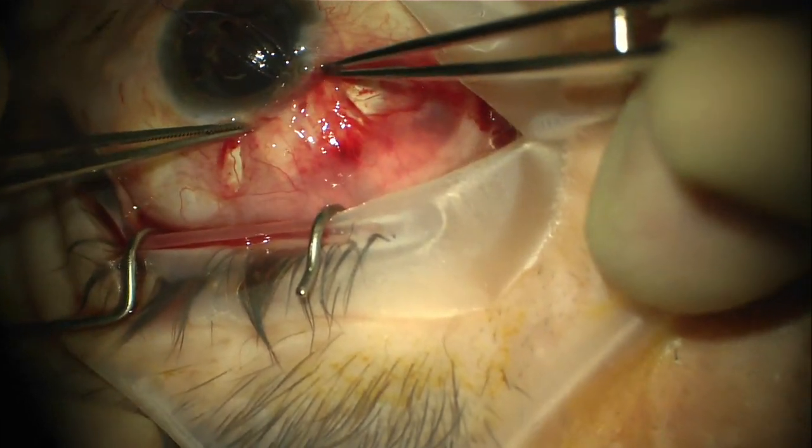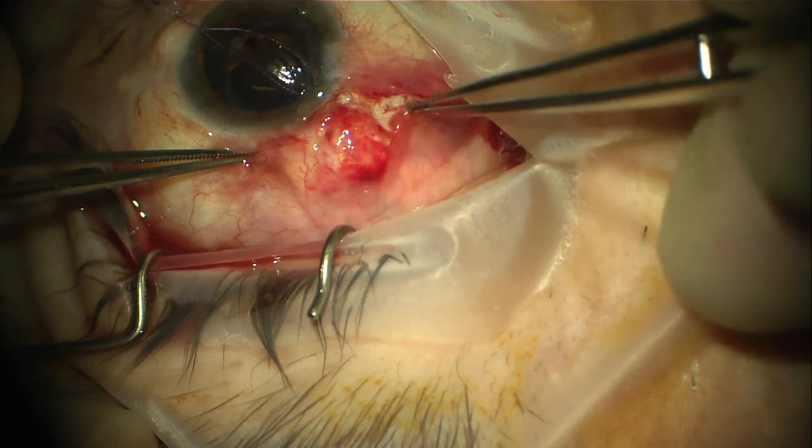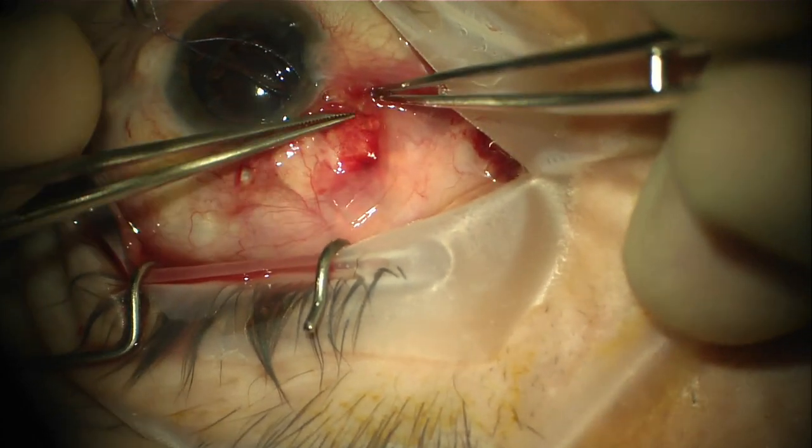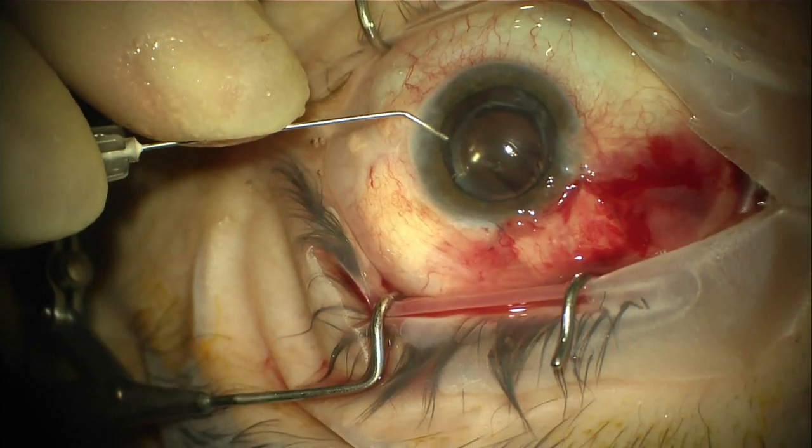The conjunctiva is finally re-approximated in the usual fashion, in this case using fibrin glue to re-approximate the tissue. Finally, viscoelastic is removed.